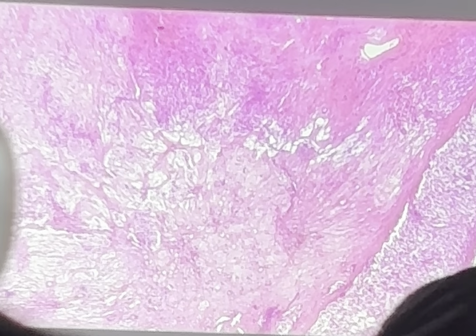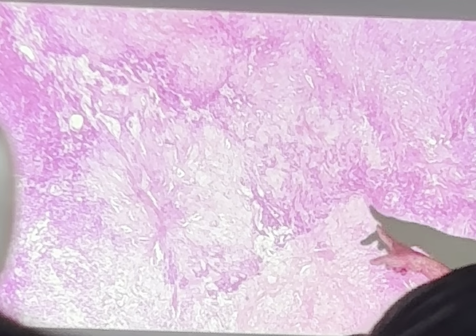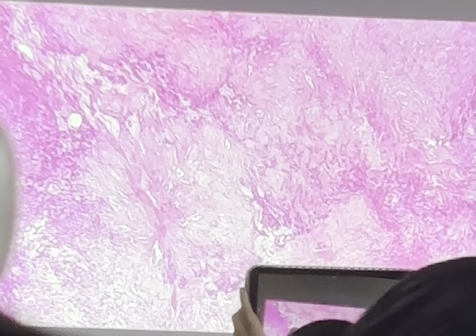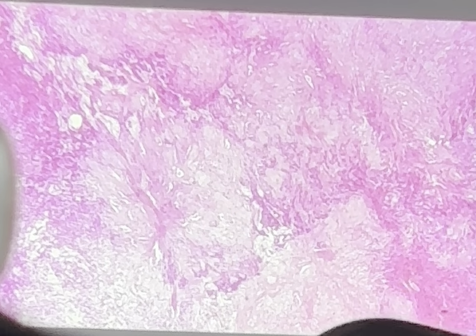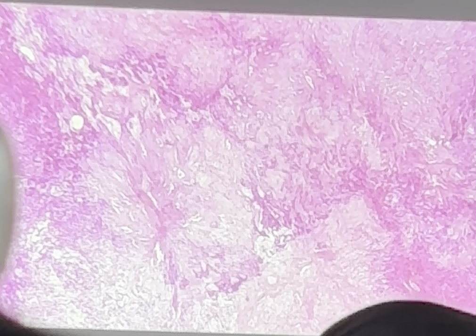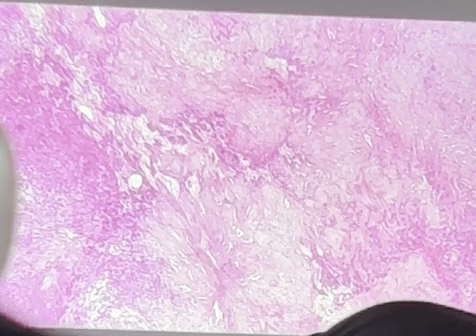So in this one, it's relatively unique. This is a mix of, here's the epithelial component, these linear cells in nests. That's the epithelial, and then we see the stromal component. That's a benign mixed tumor, pleomorphic adenoma. Most commonly seen in the parotid gland, okay? And it's the most common tumor that you see there. Although the staining here is just really bad because everything is quite pink.